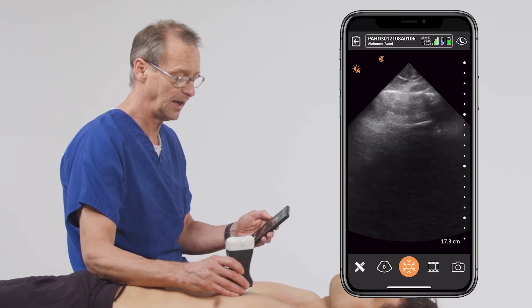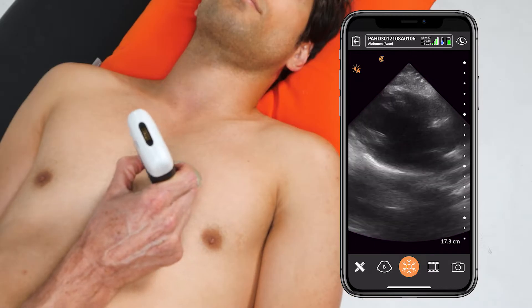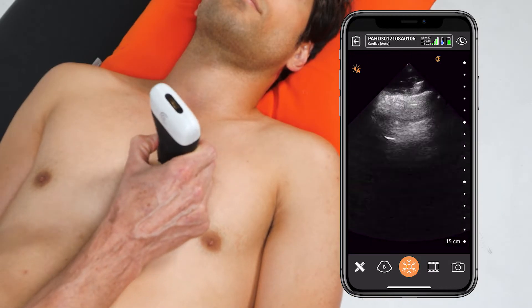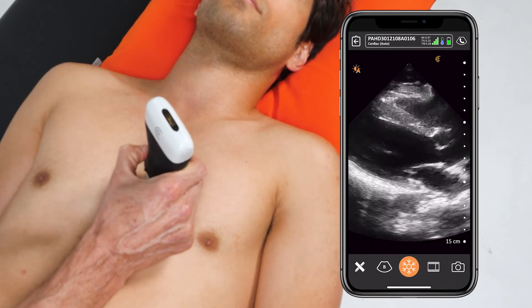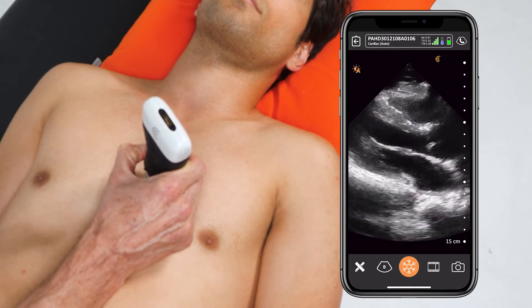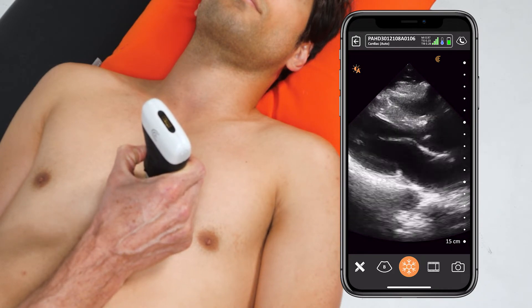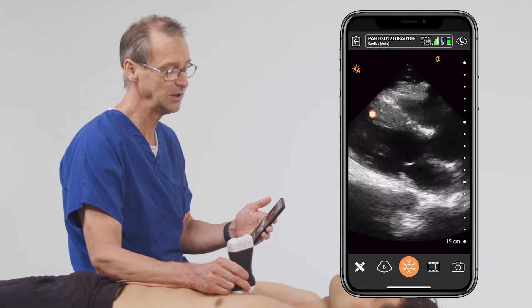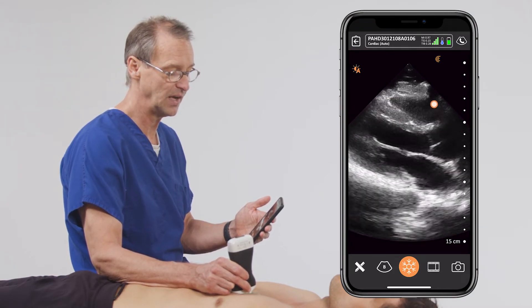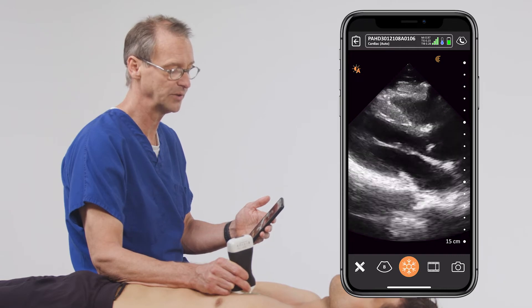Let's start by looking at the heart with a cardiac exam. We can see this is a parasternal long axis. In this particular situation, this is a normal exam. The left ventricle has normal function and the right ventricle is not dilated, as you might see in massive pulmonary embolism.